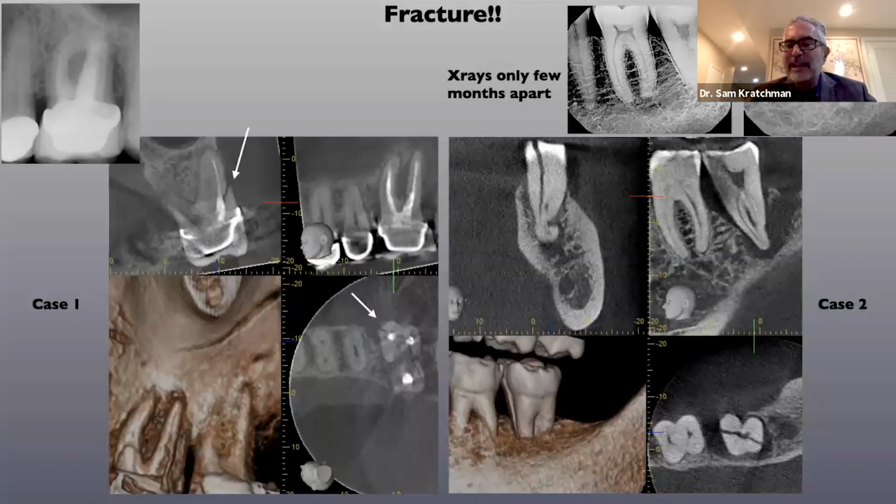And finally, just two cases of teeth on adults that I was able to see cracks. And oftentimes you can't really tell when a tooth is restored or has a root canal and crown.